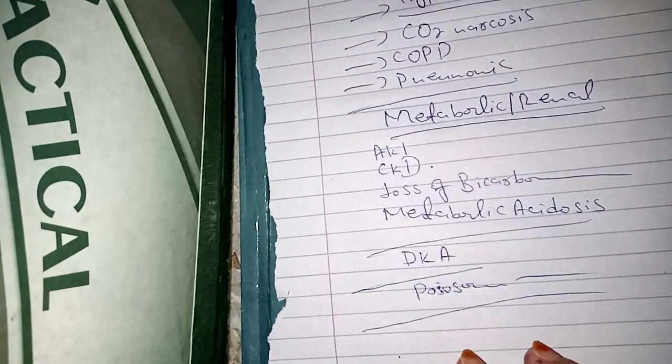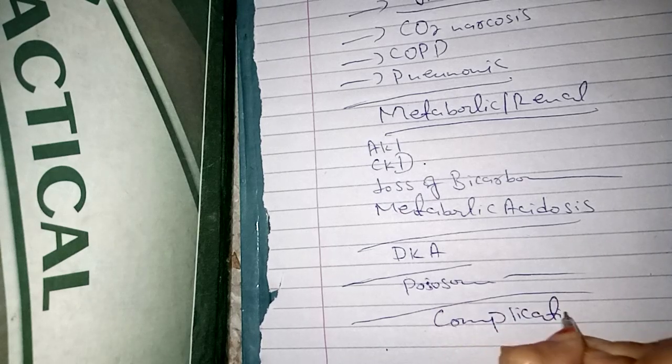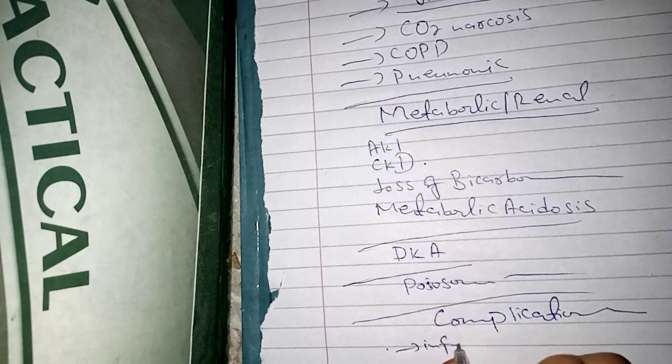You should explain to the patient or attendant about its complications during the procedure. Complications like infection, hematoma, bruise, gangrene, or ischemic issues.